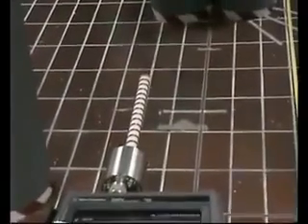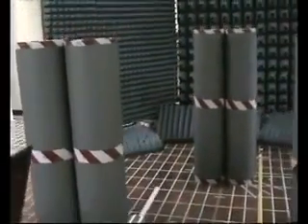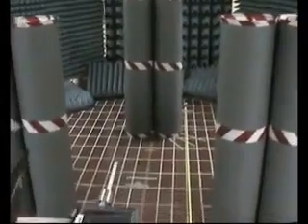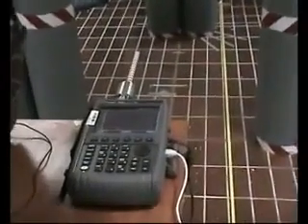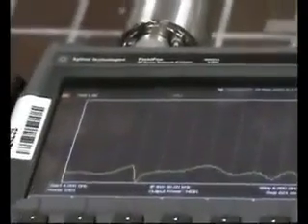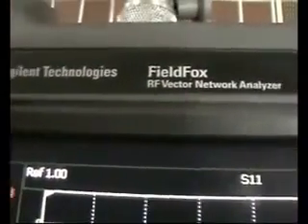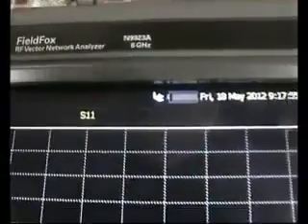First, we need to emphasize that, in the present version, the electromagnetic pulse is virtually recreated by the system. The computer drives the analyzer to carry out a frequency scan, which is performed by radiating a sinusoidal signal with the frequency increasing from 4 to 6 GHz. The choice among the frequencies depends on the performance of the instrument, the size of the antenna, and the quality of the pulse we wish to obtain.